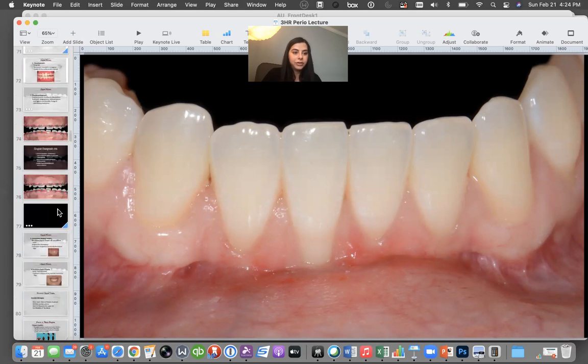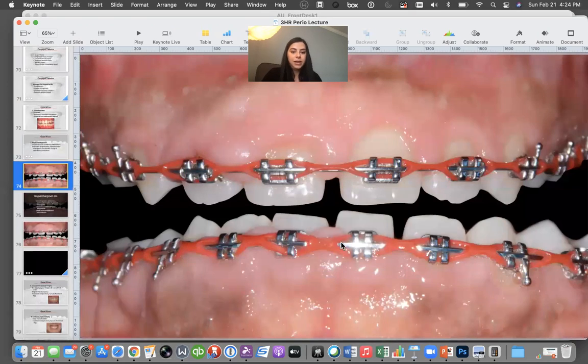Sometimes you can have negative recession, and you will see this right here. This is negative recession, a patient who has excess gum tissue that we are measuring. So you will have a ton of attached gingiva. Do you see how there's a bunch of bound down attached gingiva there? It's that really dense, fibrous looking tissue. You have a little too much, which is why it's negative. It should sit right at the CEJ, which is where the crown of the tooth meets the root, and this goes above and beyond the CEJ. So instead of having recession, which is gum tissue loss, we have an excess, which we call negative recession. You chart it on the periodontal chart by hitting the negative and then putting the number.